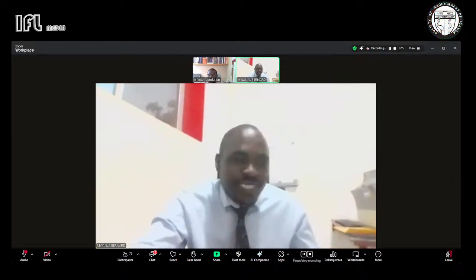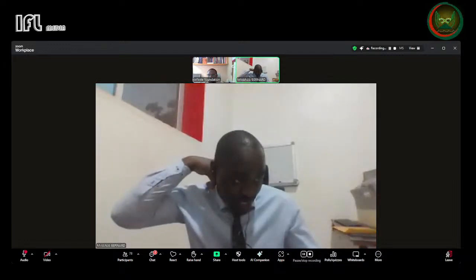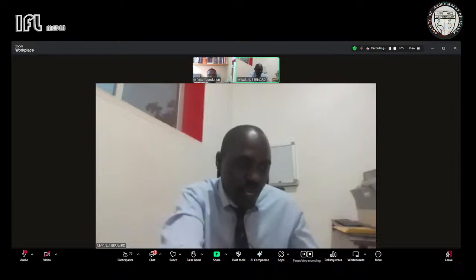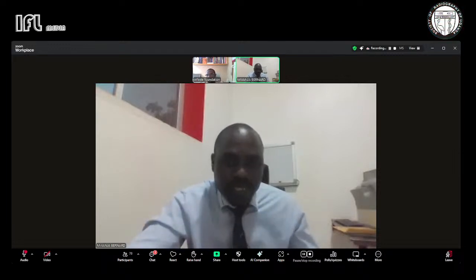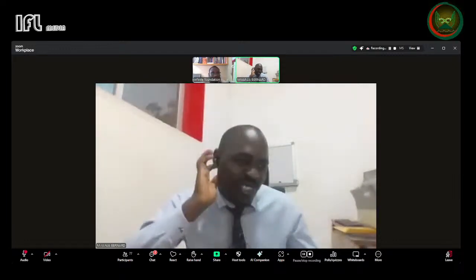Who do I throw these to? Amina, you did present about MCA, so you will be answering Dr. Dominic. And then, our vascular scientist, Mr. Lukenge, question 1 is for you. Then PI, RI, SD ratio, which one is more important, I think this is also for you, Mr. Lukenge. Mr. Lukenge, how do we calculate the mean if one wants to?